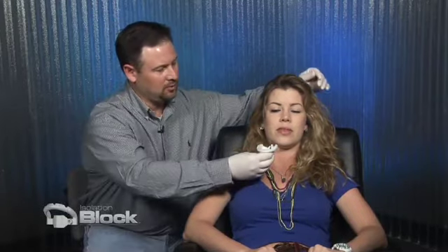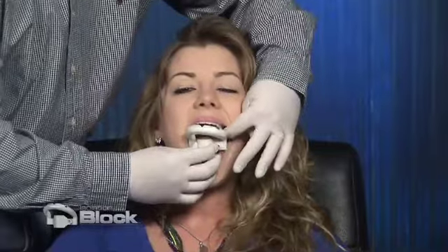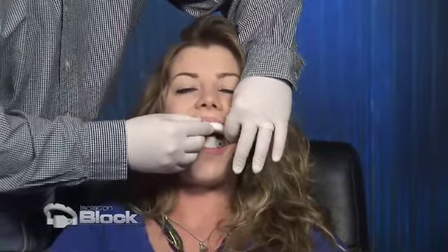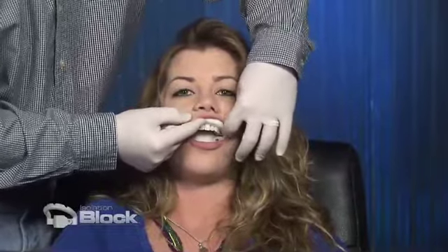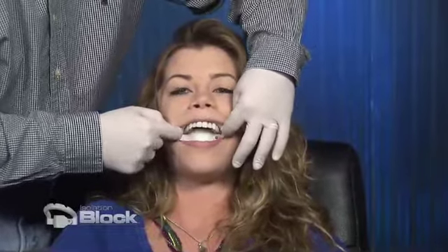The easiest way to place the isolation block is just to get a hold of the tongue shield, give it a little bit of a squeeze just to make it a little bit more narrow to get it in the patient's mouth, and then you just have the patient open wide. Then once you have it in place, have the patient bite down slightly on the bite block, and then you just pull the lip up over the lip retractor.